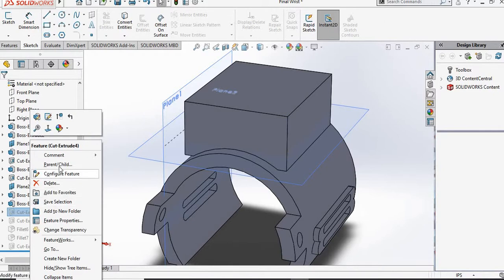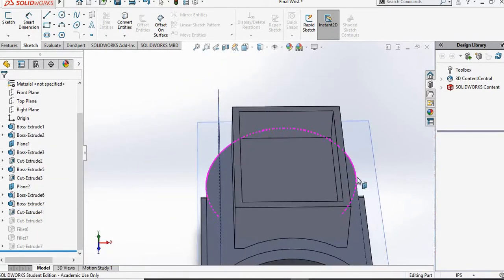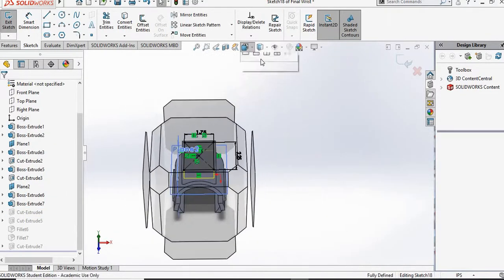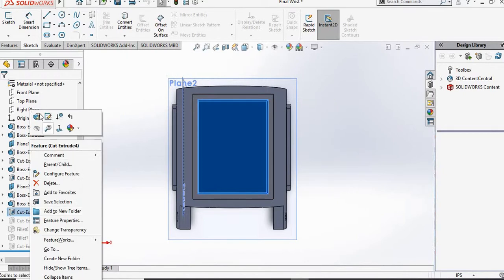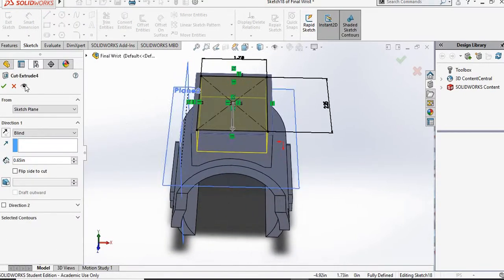Then after we made that box on top of our wrist bracket, we went ahead and made a cut into the box with the following dimensions. Again, this was done from the top plane. So we go to our top plane and add a rectangular box with the following dimensions. And our cut extrusion was 0.65 inches downward.